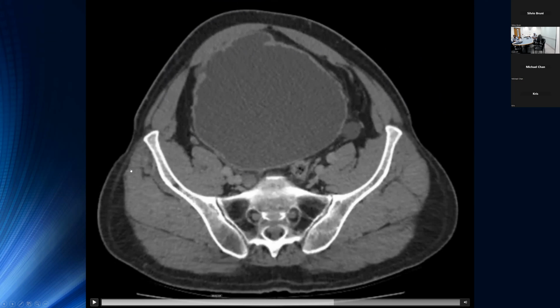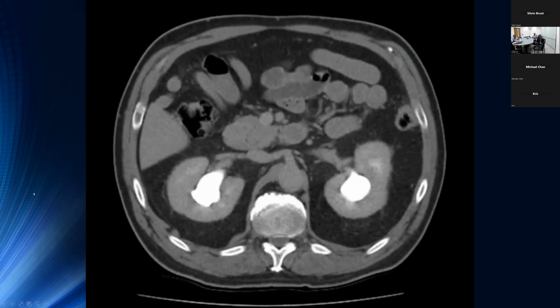So in a case like this, quite severe, we may even after the 2 minutes not get a lot of contrast down to the distal portions of the ureter, but that I don't think necessarily is going to necessitate an additional longer wait. But by all means, just contact the consult rad and ask them if they think it warrants additional imaging or if you can call it at that point.